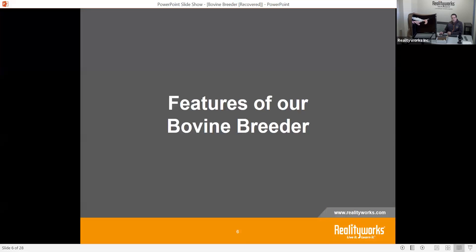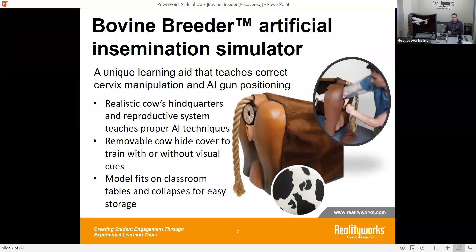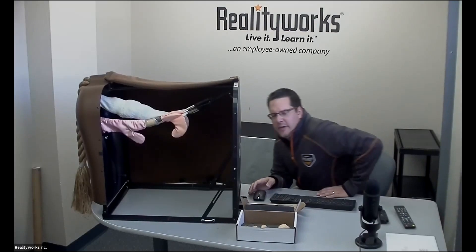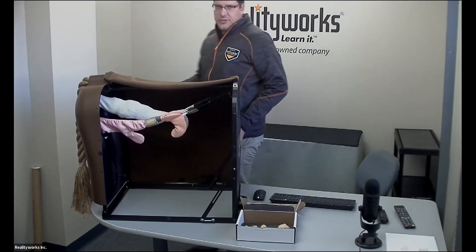We're going to talk a little bit about the features of the bovine breeder. We have a very unique and helpful tool here, and we're going to hear from a teacher who is using this. The bovine breeder is a realistic hindquarters and reproductive system of a cow.